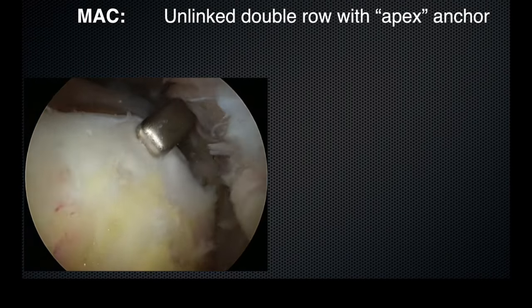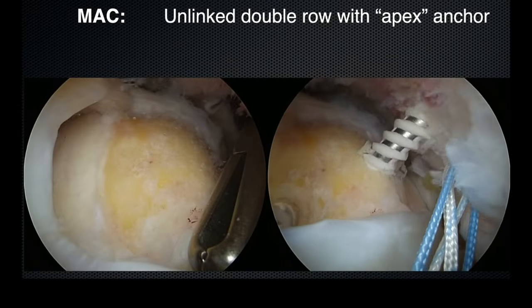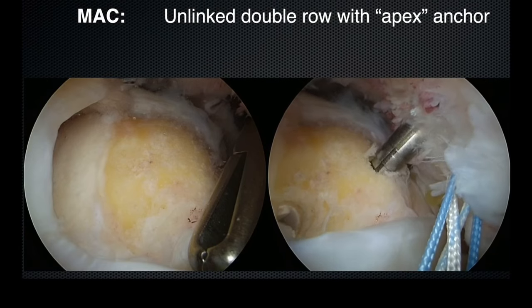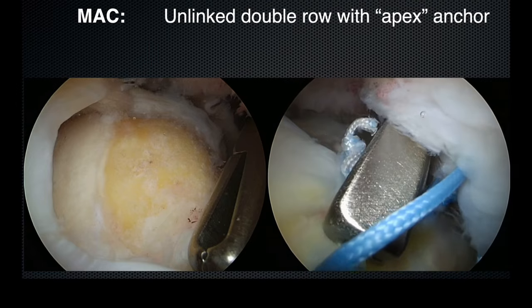We can see here that this is a nonlinear tear reduction vector, with the posterior rotator cuff wanting to turn the corner. A lateral row anchor at the apex of the footprint is then inserted, and simple sutures are passed and tied down. Then the medial row sutures are tied down and cut.